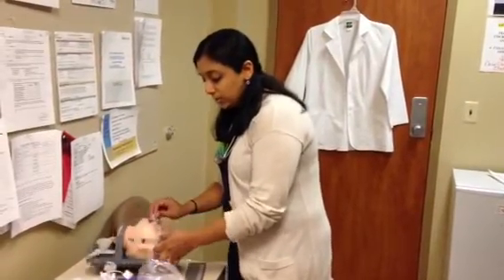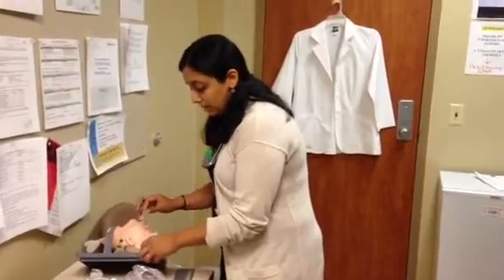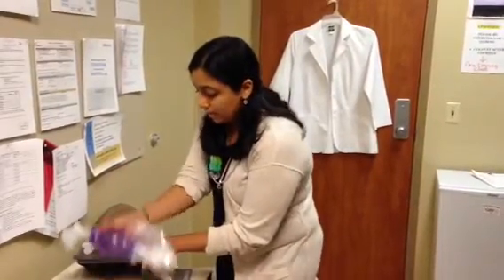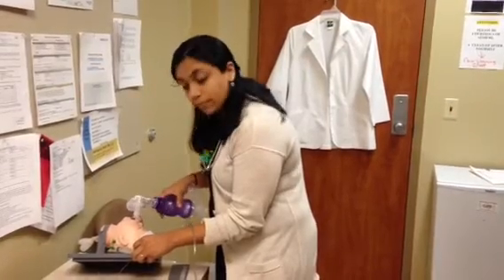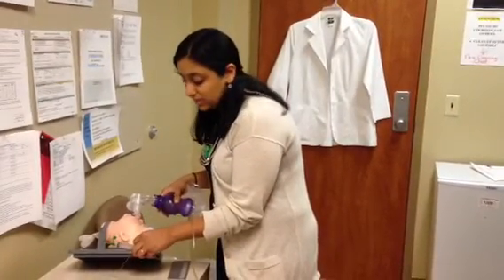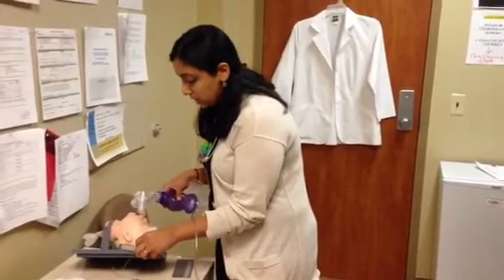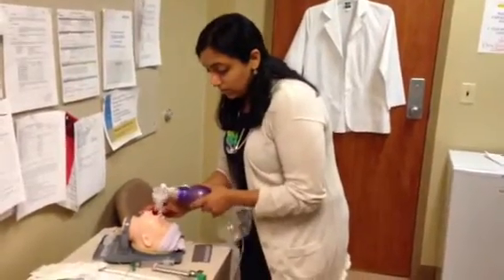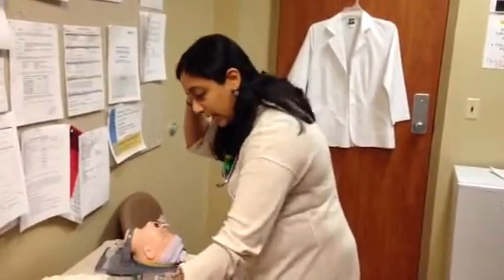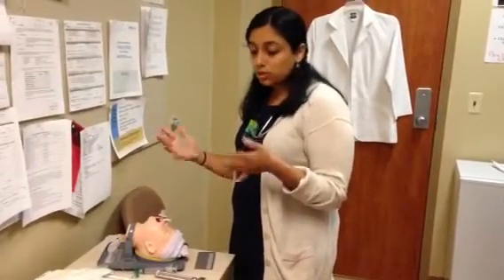And then again, push the rest of the surfactant in that position, and then again pull out the NG tube and bag that infant so that surfactant can get pushed into the lung. Okay? And again, we bag for at least 15 seconds. Most institutions do it between 15 and 30 seconds to make sure that the surfactant is cleared. Once that is done, you can place the infant supine again, and that's it. You have to mark the date and time that the surfactant was administered.